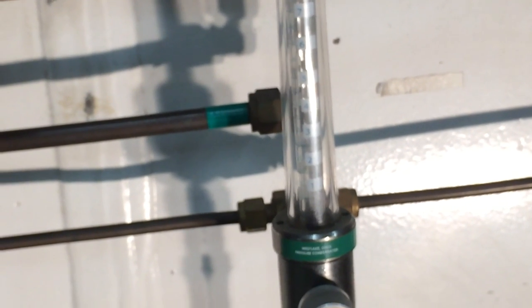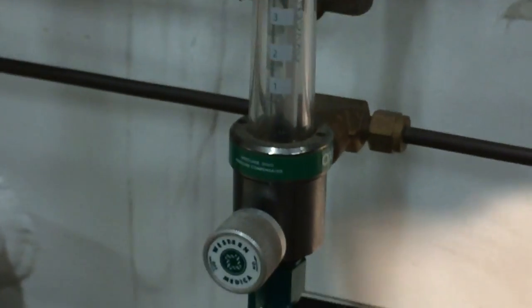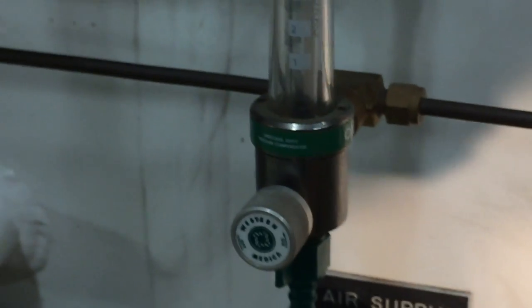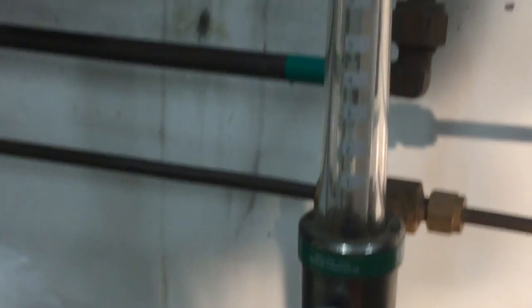The flow meter is set to two liters per minute. There's a small ball inside the flow meter, and we open the valve counterclockwise with our fingers to get two liters per minute of flow. That flow is discharged through this piece of Tygon tubing, which is connected to the oxygen analyzer.